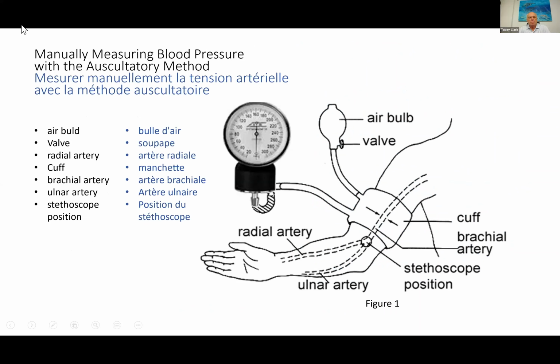Yes. So another common problem I see is if the monitor is set up for the wrong type of patient. If you have a monitor that is set for a neonatal patient and it's being used on adults, a lot of times it won't be able to get a blood pressure because it's starting at such a low inflation pressure.